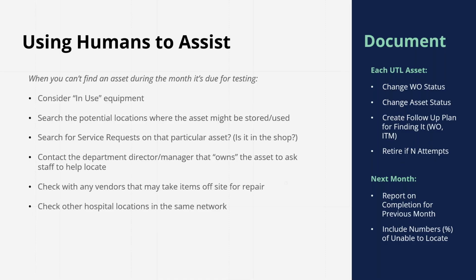I hear so many times technicians put things in the notes, couldn't find it. Even on the facility side, there's an exhaust fan on the roof that got taken out, but PMs are still coming out for it. They put it in the notes, but the managers aren't looking at the notes. Nobody's looking at the notes. So as part of your feedback loop, which I talked about earlier, is the equipment still here?